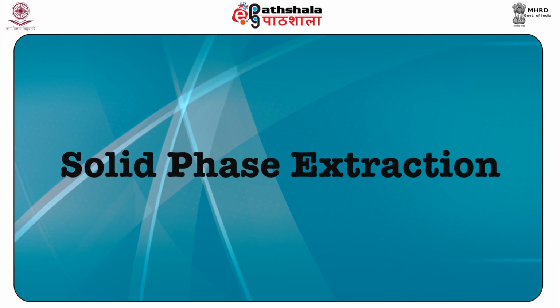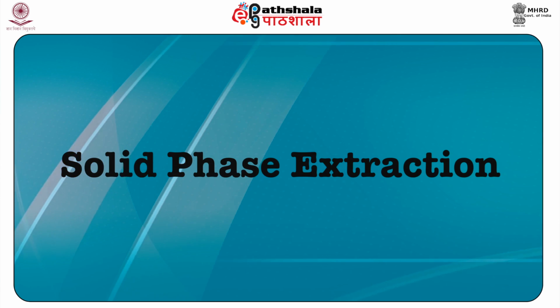Next comes the solid phase extraction process. The old observation in the extraction of drugs by adsorption on solid materials, that is Florisil, a synthetic magnesium silicate, or activated charcoal, and the selective elution of solvents thereafter, has given rise to the solid phase extraction method.